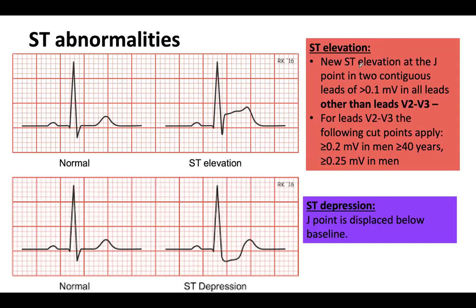So ST elevation is when there's new ST elevation at the J point in two contiguous leads. So remember that to call it an MI, you need to be thinking about the amount of elevation there is and the number of leads it's present in.